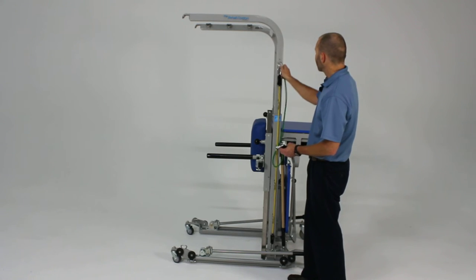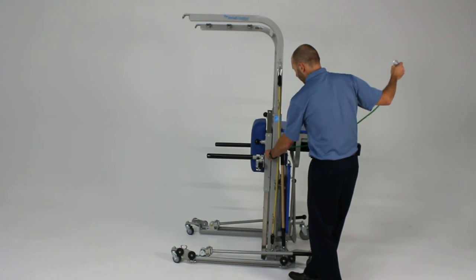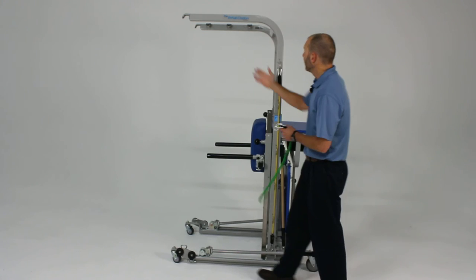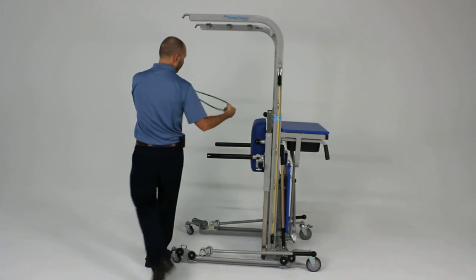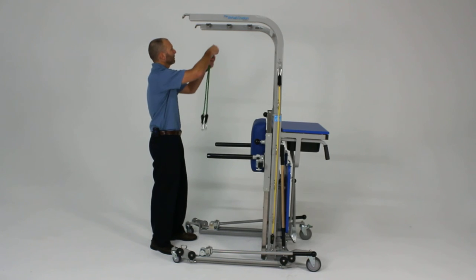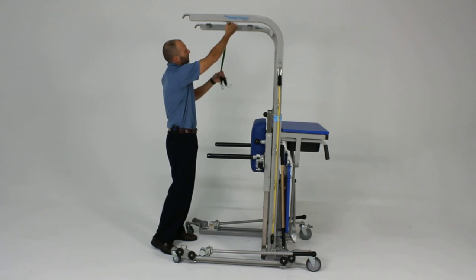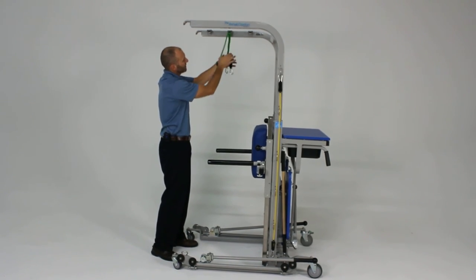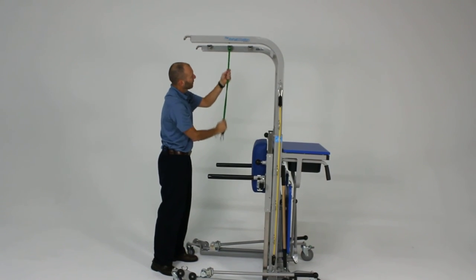You can also attach resistance cords to the upper portion of the unit by doing what's called a girth hitch, where you simply double up the cord, take that looped end, extend it through, and then drop the ends down through that loop to hang it.